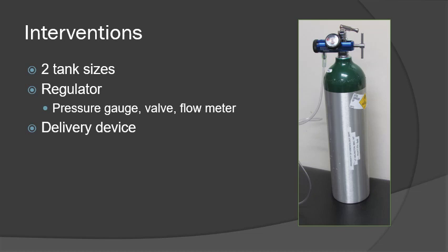Your nasal cannula is going to deliver a low flow of oxygen. The non-rebreather and the bag valve mask both deliver high flow oxygen, and the textbook goes over the liters per minute that get delivered with the different delivery systems. So take a look at that, and again, we'll get more in depth into the decisions that go into what type of delivery system you would use.